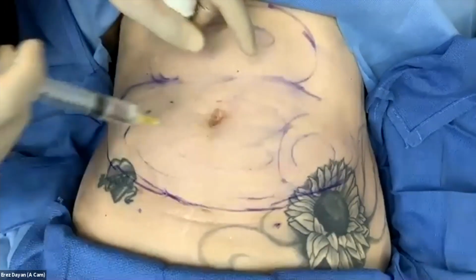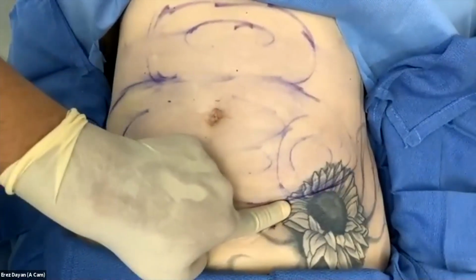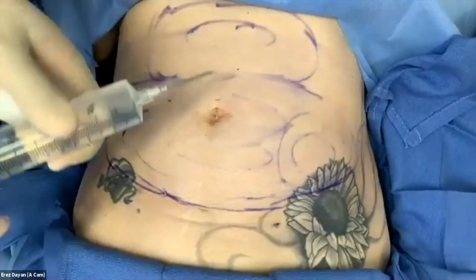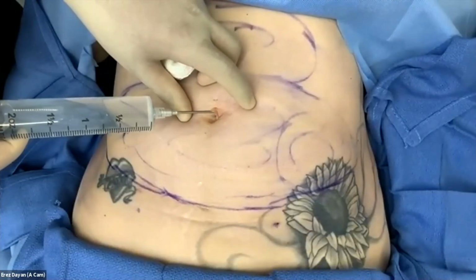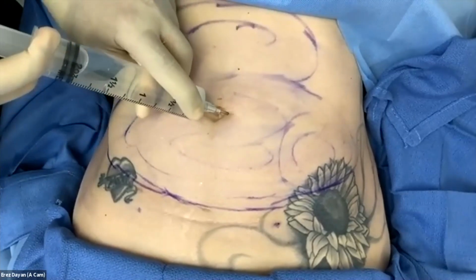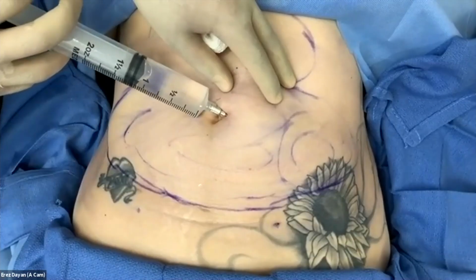Now, initially I would normally come down here, but she already has a little bit of a contour indentation here, so I don't want to exacerbate that, so I'm going to just come this direction. So that was the local there. I'm just going to come in here. Do you feel that at all? Okay, good. So again, I want to get in the suprafascial area. So I'm going pretty deep. I don't want to feel any resistance here. See how easily it's going in and just filling up that space, so I know I'm in the right place.